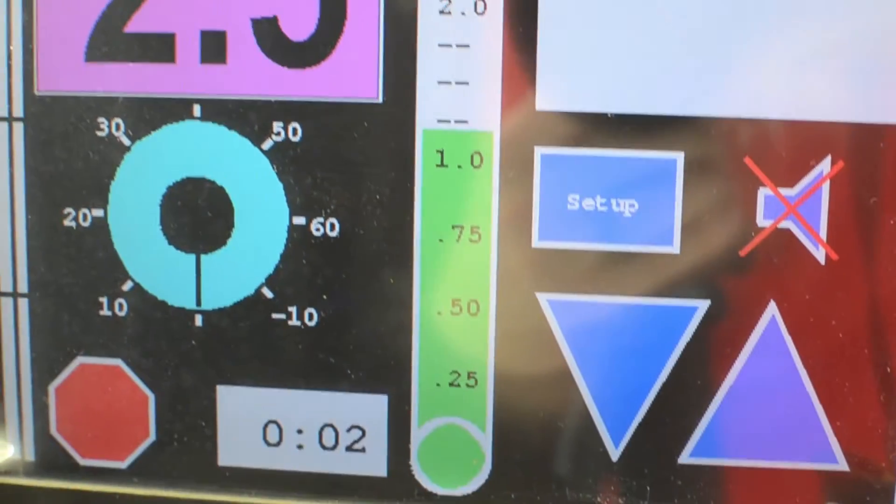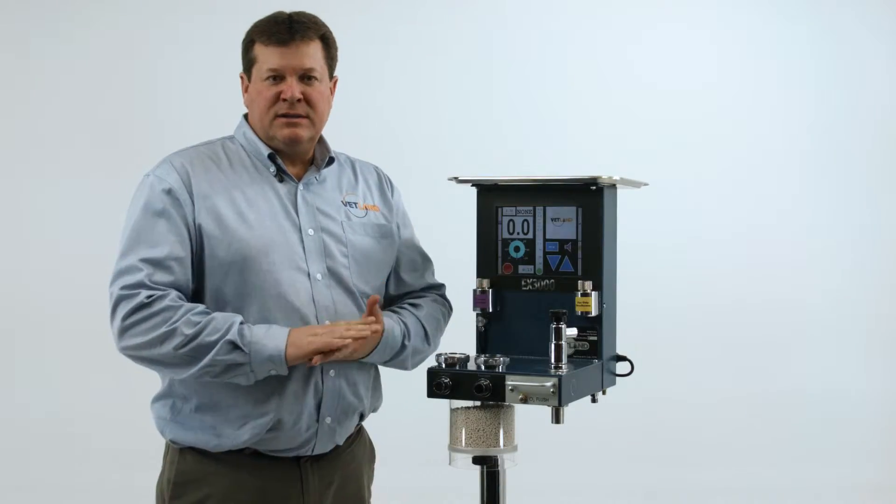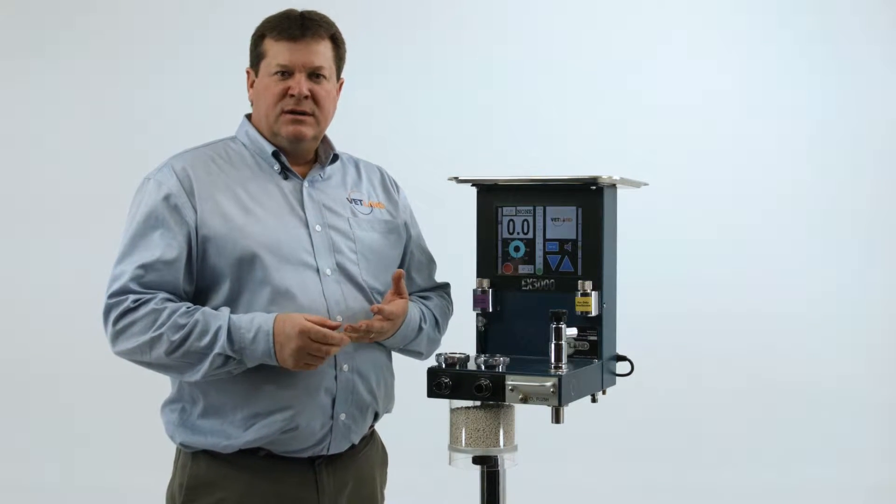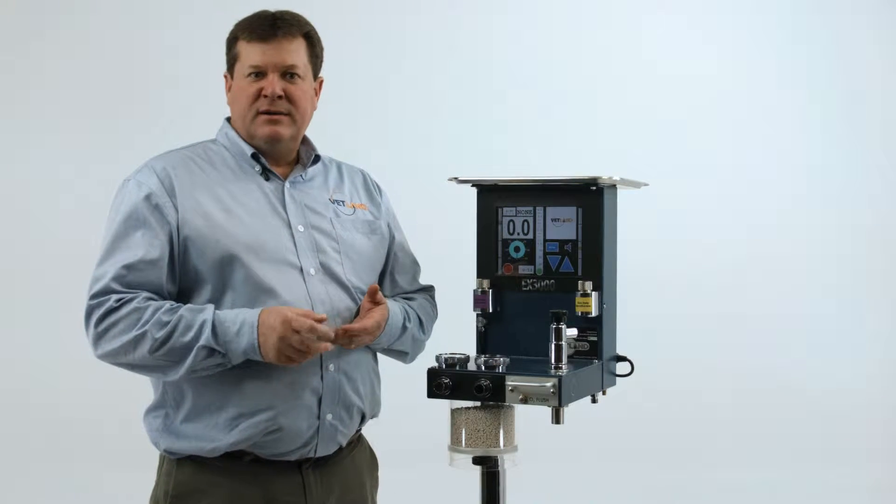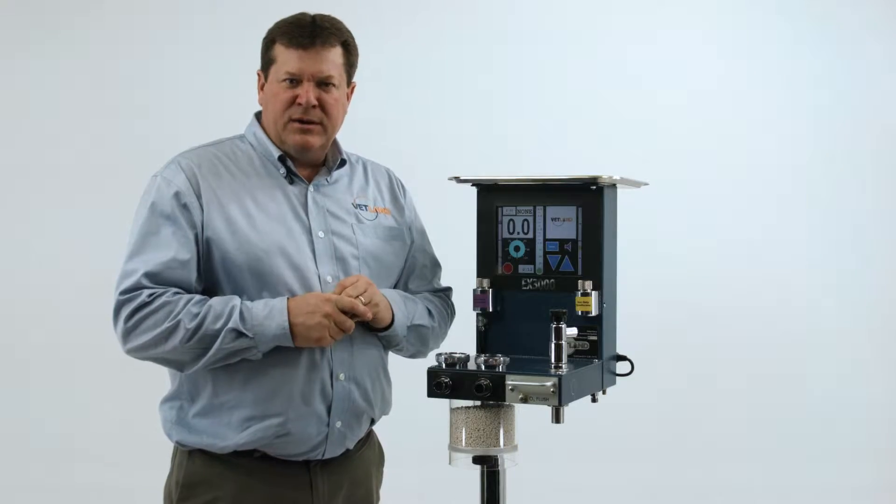This machine was born out of a desire to create a safer system. The top five things that lead to accidents and injury under anesthesia are excessive pressure to the lungs, excessive anesthetic, lack of oxygen to the brain, lack of CO2 removal, and foreign matter entering the airway.